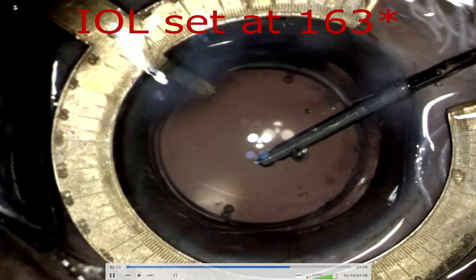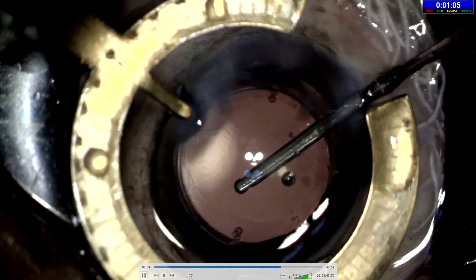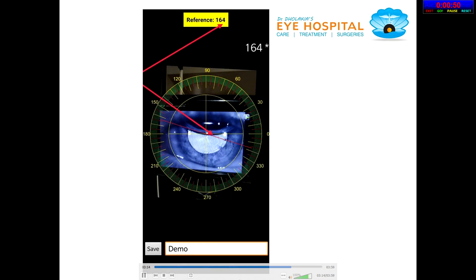In this fashion, we can align the toric lens as per the desired axis because we have a 360-degree protractor. Post-operative IOL axis location into the eye — we take a snapshot of the illumination image of the eye in our autorefractor. The Crystal Toric app will help depict the exact IOL position into the capsular bag. This lens is set at 164 degrees.